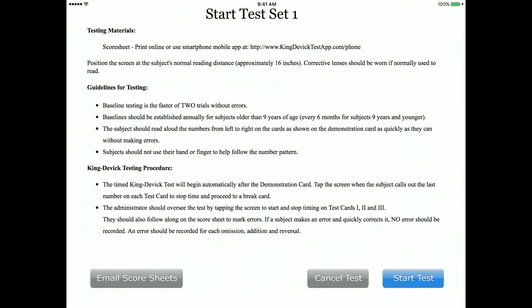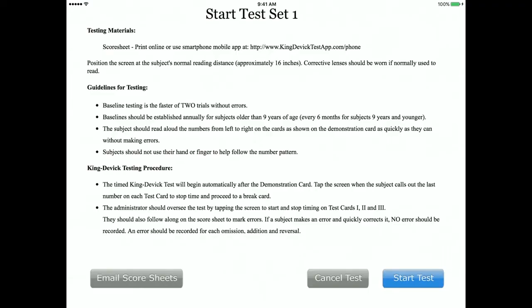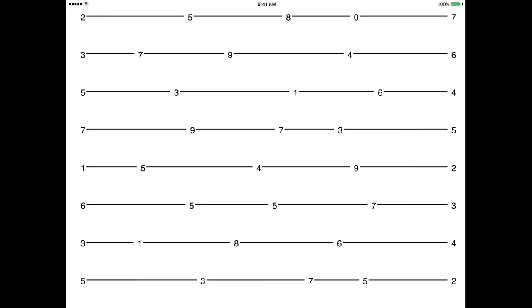Read the instructions carefully prior to testing. The test administrator should have the corresponding score sheet ready to record any errors. Email score sheets to yourself by tapping Email Score Sheet, or view the score sheets online at www.kingdevictestapp.com/phone. Tap Start Test to begin. The subject calls out the numbers from left to right as quickly as possible without making errors — the subject may not use their finger to track the number pattern. The test administrator times the test, tapping the screen to start and stop time for each test card. Time begins after tapping the demonstration card. Tap the screen when the subject calls out the last number on each test card to stop time and proceed to a break card. Repeat with test cards 2 and 3.